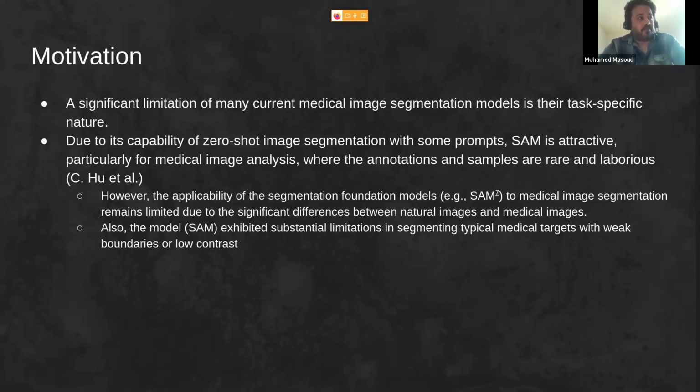We don't have a foundation model, and even the SAM model looks attractive and has this zero-shot image segmentation capability. This attractive feature of the SAM model shows that we can use something similar in the medical field, where we have rare data and a lot of annotation labor needed in that domain. But this capability is very limited, as we see from the previous results.